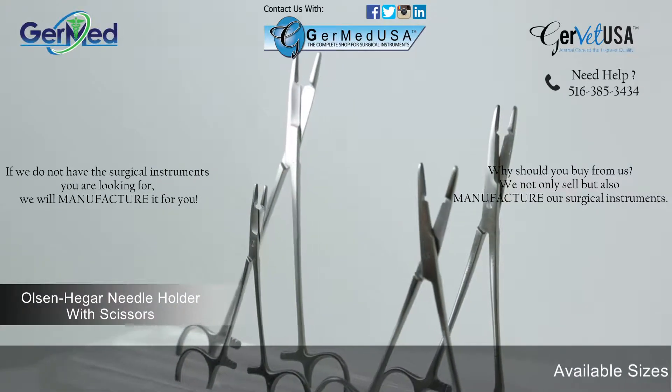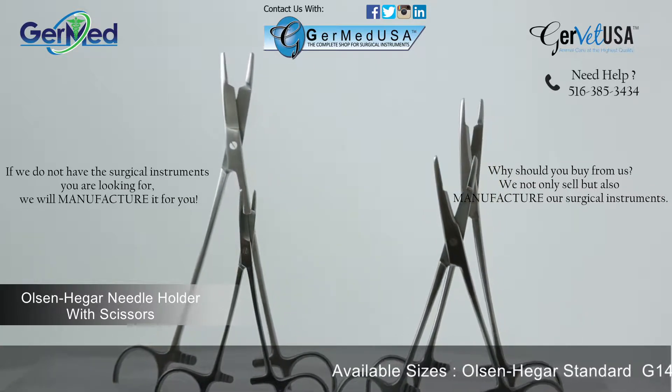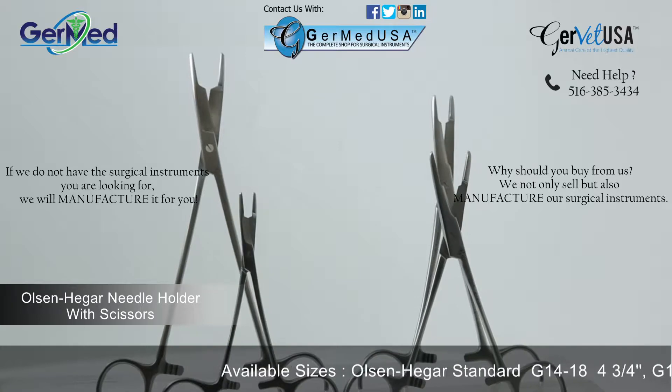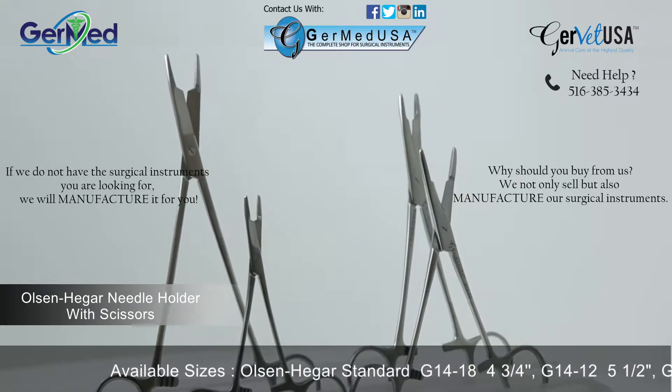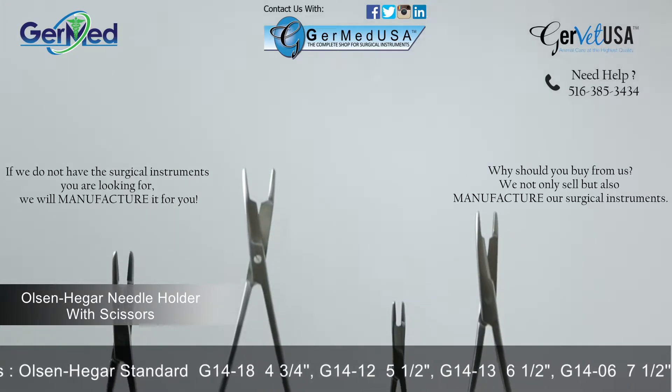GerMed provides Olsen Heger needle holders in a variety of lengths with serrated jaws and smooth jaws. Olsen Heger needle holders are a ratcheted finger ring instrument used with sutures of intermediate weight.